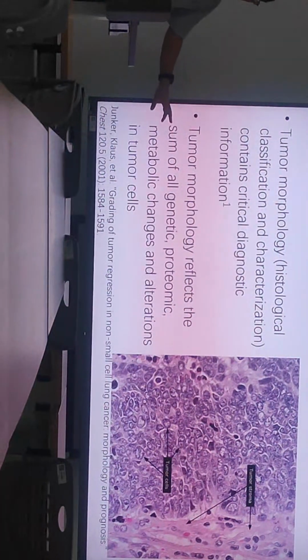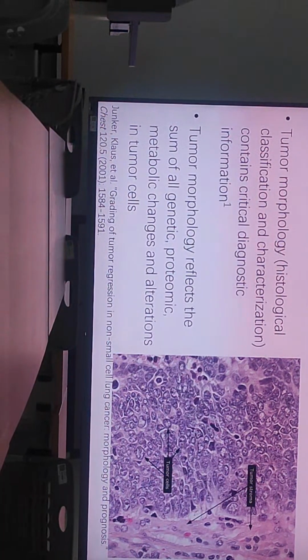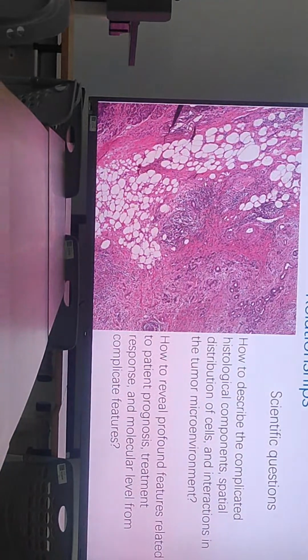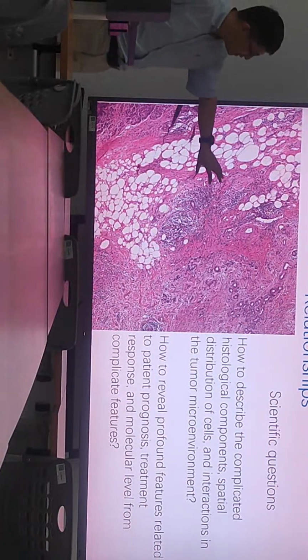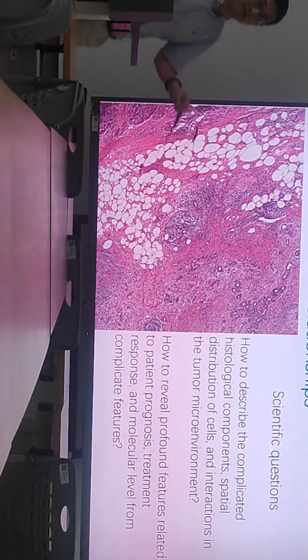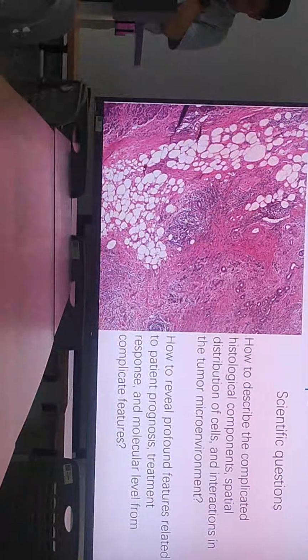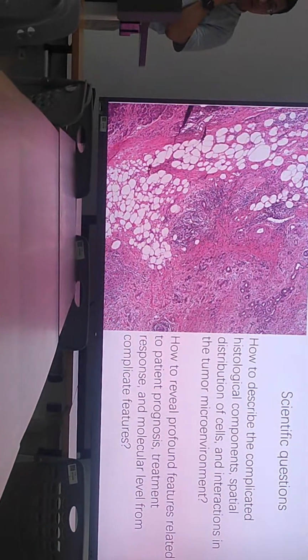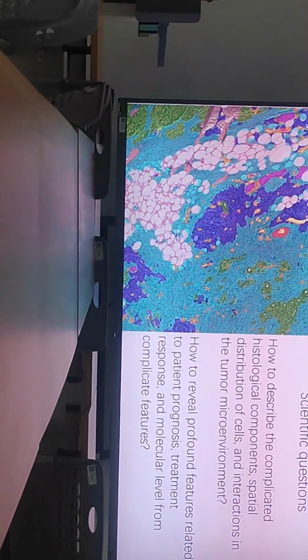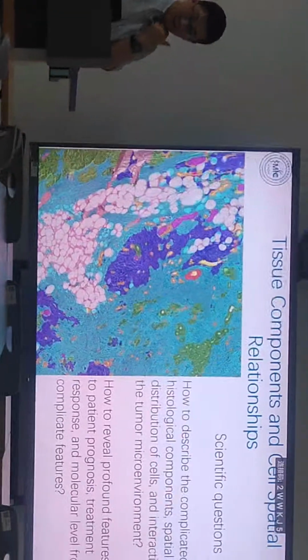This is very hard, because the image is very complex, with a lot of tissues, a lot of cells, and very complicated structure. Based on the foundation model, we can quickly segment different cells and tissues together.